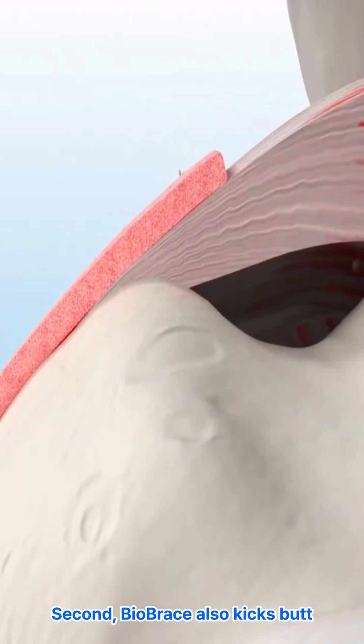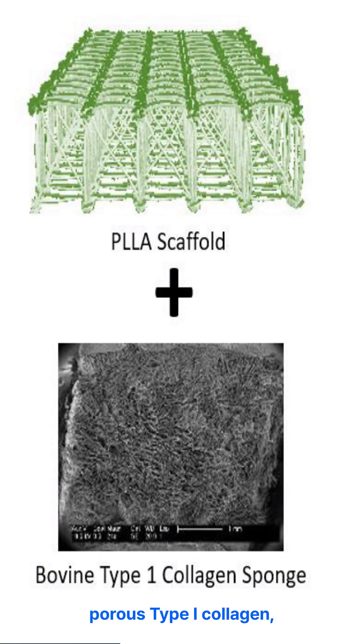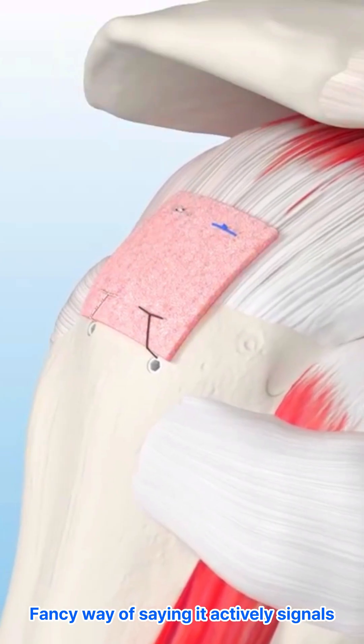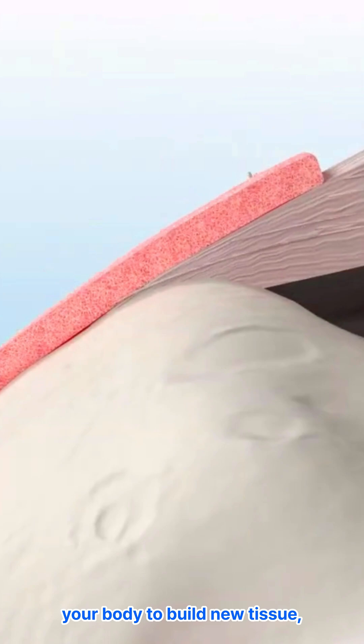Second, BioBrace also delivers on the biological healing side. It has a really porous type 1 collagen, which is bioinductive — a fancy way of saying it actively signals your body to build new tissue.